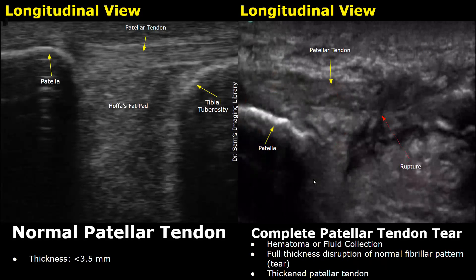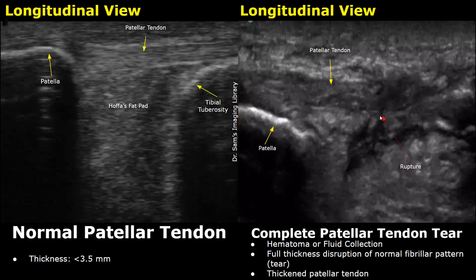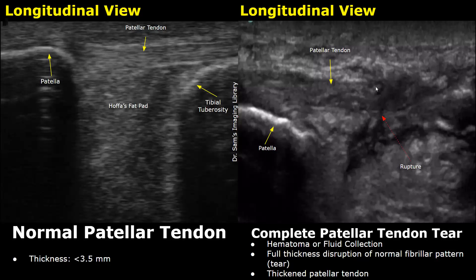Here we have a complete patellar tendon tear. There is a full thickness disruption of the normal fibrillar pattern — this is the tear, involving the entire thickness of the tendon, which indicates a complete patellar tendon rupture. It is surrounded by hematoma; these heterogeneous areas are the hematomas. The tendon is thickened as well.